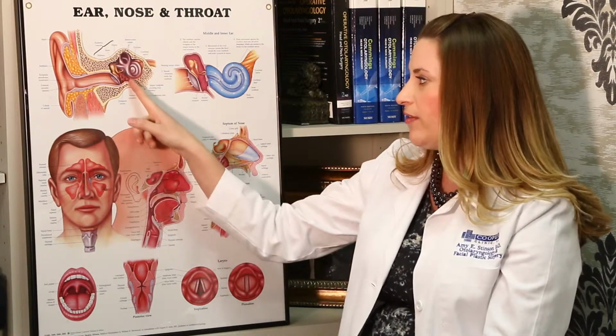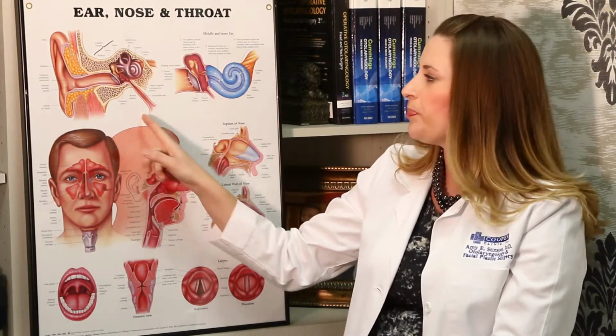The whole purpose of placing a ventilation tube is to replicate the function of this natural eustachian tube. The way that we do this is in a surgical suite with children because they can't tolerate laying flat and still for that amount of time. All they require is a little bit of gas anesthesia. They usually don't require an IV or any more medication than that.